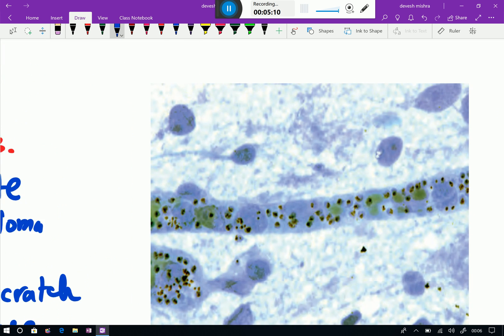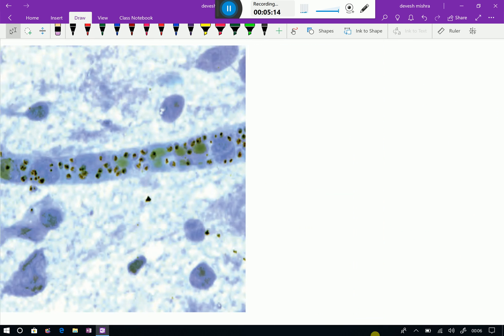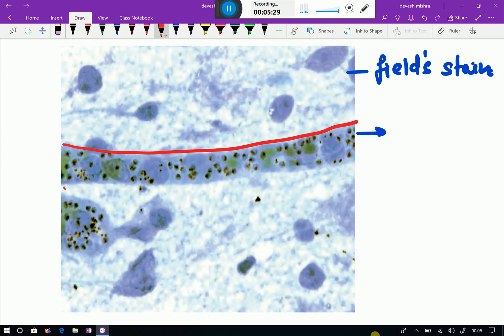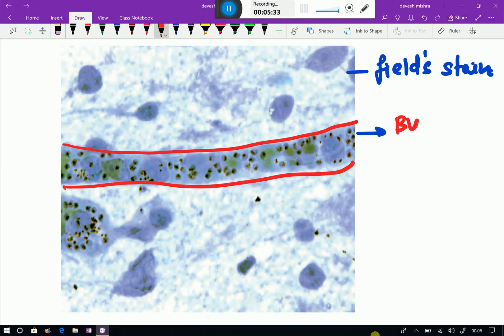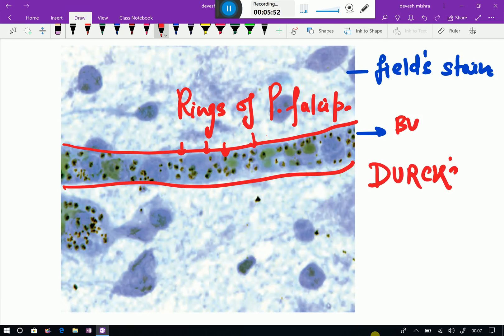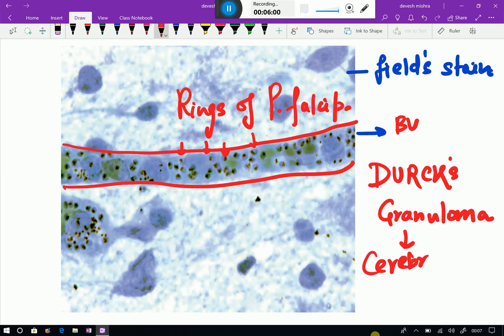There is another different granuloma — this is the autopsy of the brain. It is an example of a field stain. You can see this is the blood vessel. Inside the blood vessels, these are small round ring-like structures — these are the rings of Plasmodium falciparum. This special type of granuloma is called Durck's granuloma, which is seen in cerebral malaria.